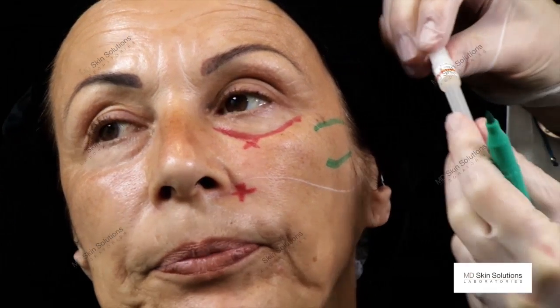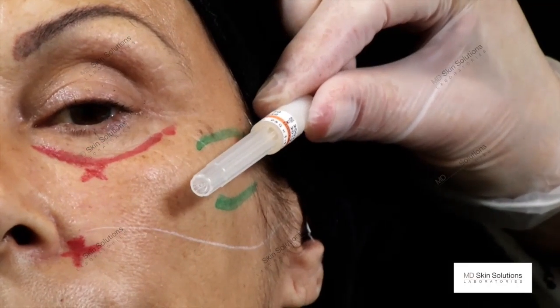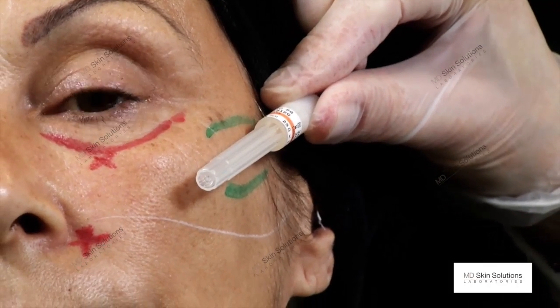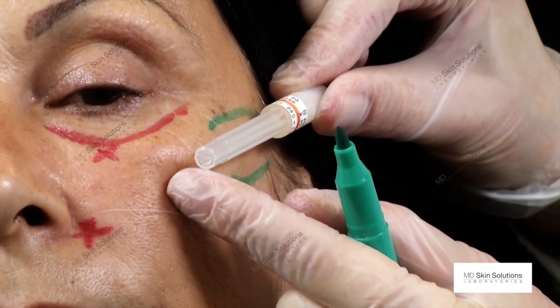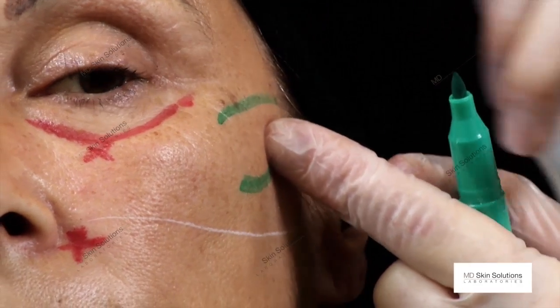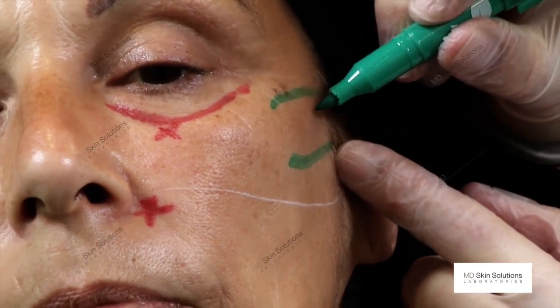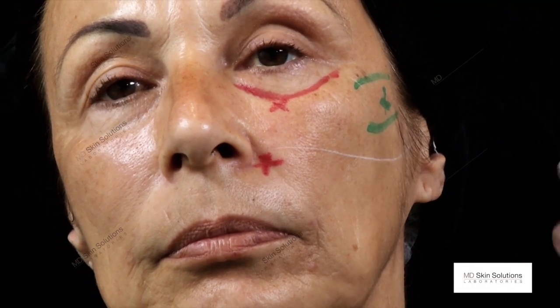I will use a 25 gauge 1.5 inch blunt tip cannula, and as this cannula reaches up to the next entry point, once I insert it in the middle of the zygoma, I will choose my first entry point here. That's the zygomatic arch entry point.